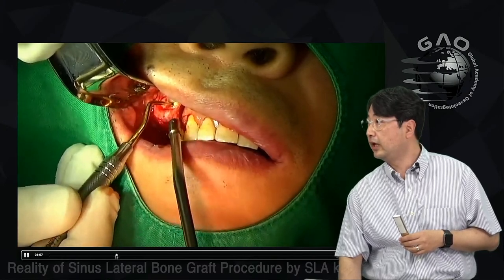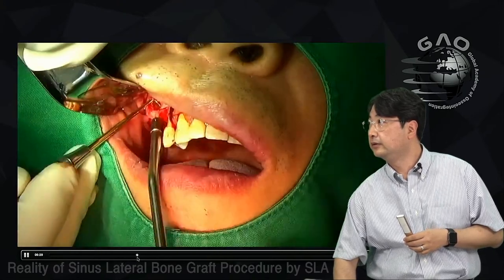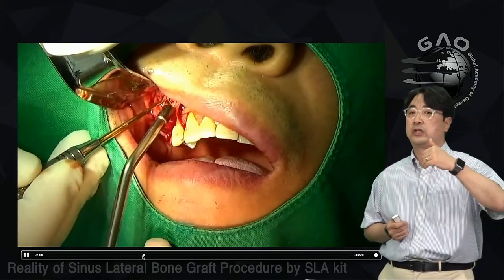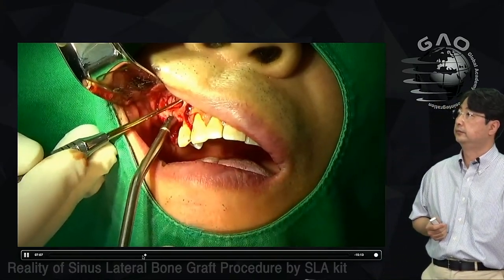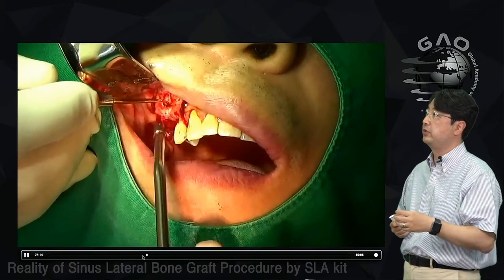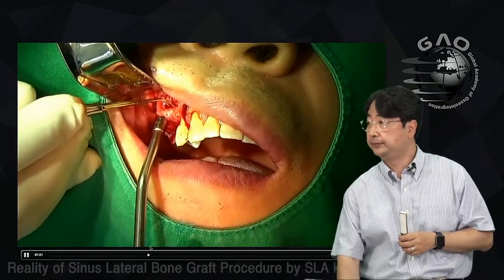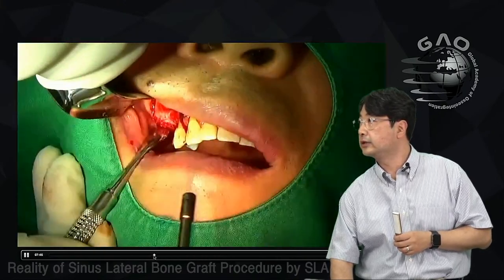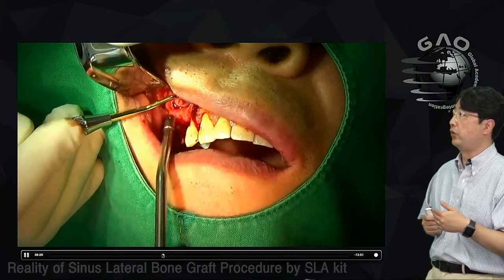A little bit above, then medial and distal, right? Now I'm using 2 to go down, right? From 2, you can go from the window to the crestal part. I'm not pulling down; I push out. And the tip of the instrument has to touch the bone, right? Then I'm using the wider part of number 2. Like this. And now I have number 3, right? To go further and to go down more.